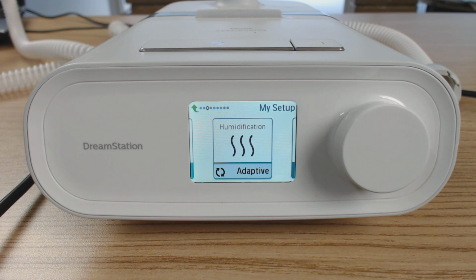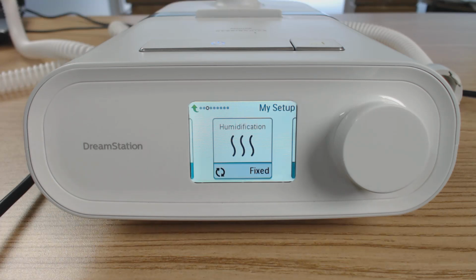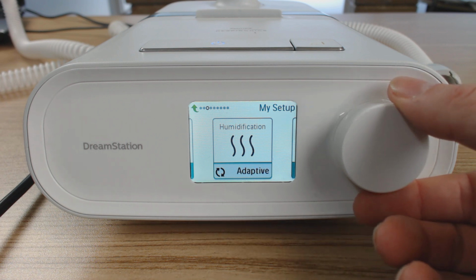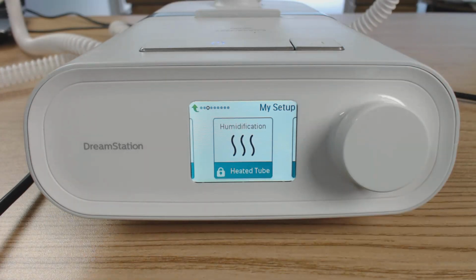Adaptive means the machine's going to monitor the ambient humidification in the air, and then it will adapt. So it will change the temperature of the heat plate to deliver optimal humidification. Fixed means that we're setting the fixed temperature of the heat plate, so the fixed humidification value. I reckon if you don't have heated tube, go adaptive. But once we put that heated tube in, it locks it in. There's nothing you can change anymore.